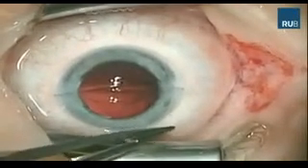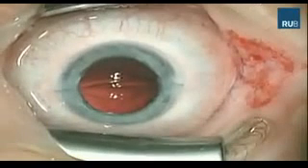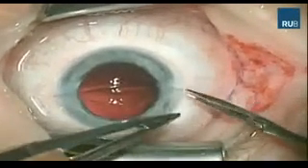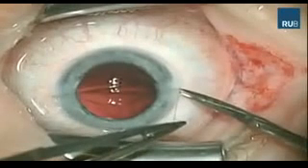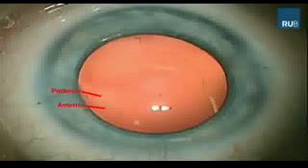The final retro-illumination stereo-coaxial view shows a near-perfect, well-aligned and centered anterior as well as posterior capsulotomy. The diameter of the anterior capsulotomy is 4.6 mm and 4.5 mm for the posterior capsulotomy, which can be regarded as optimal for secondary lens implantation like bag in the lens or other lens modalities.